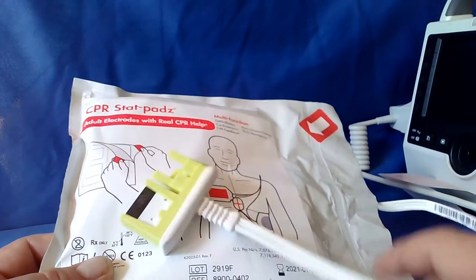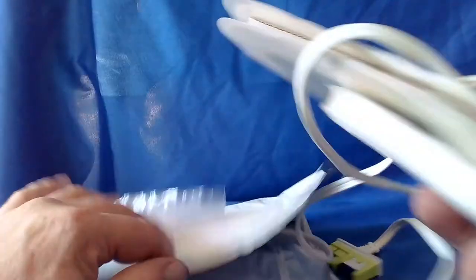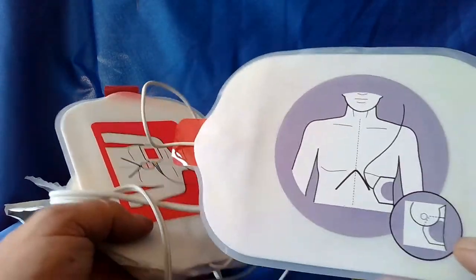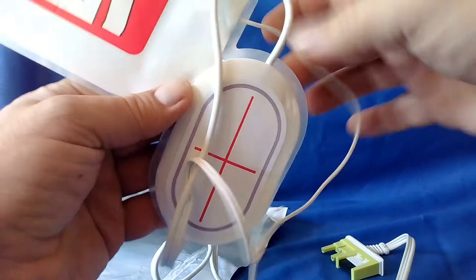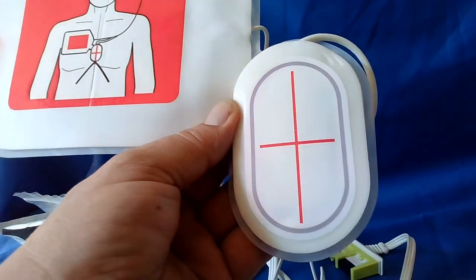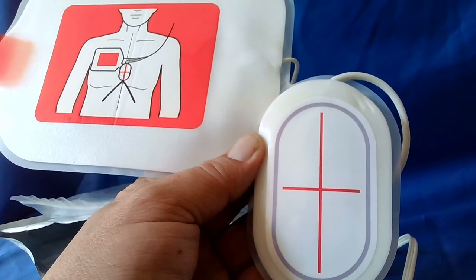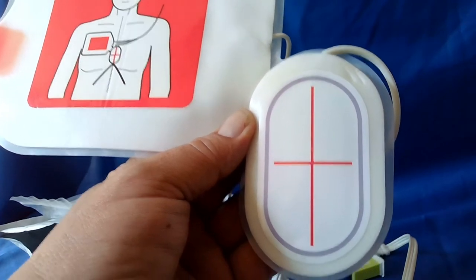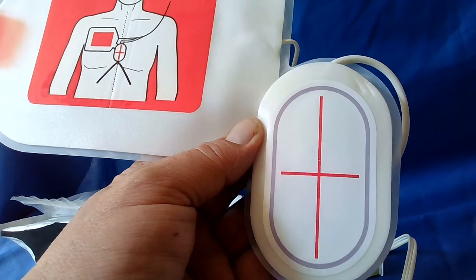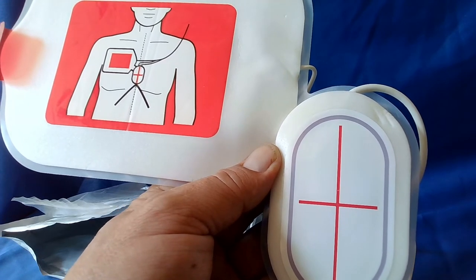If we open these pads, open your pads up. As per the picture, you have your apex pad and you have your sternum pad along with your accelerometer. What is the accelerometer? This is what gives your device the feedback in terms of the quality of your CPR. And this will measure your depth, your rate, and your recoil. And it will show it as a value on your device when you're busy with defibrillation.